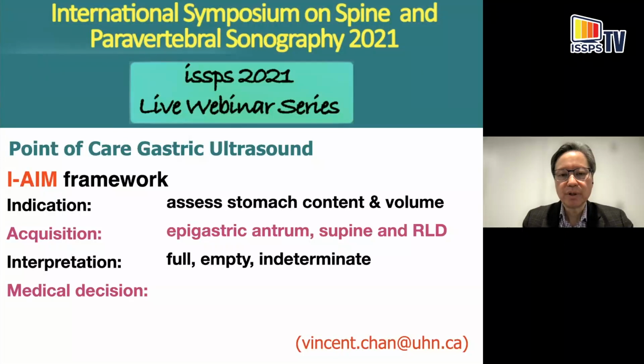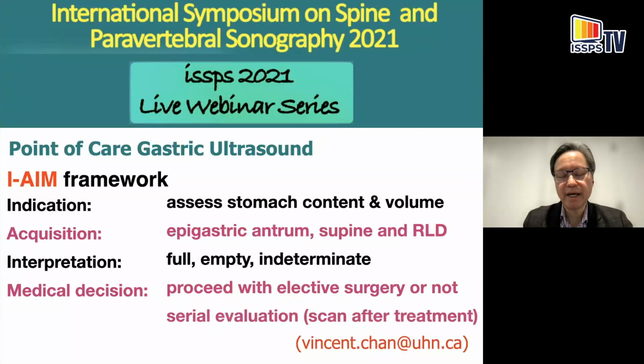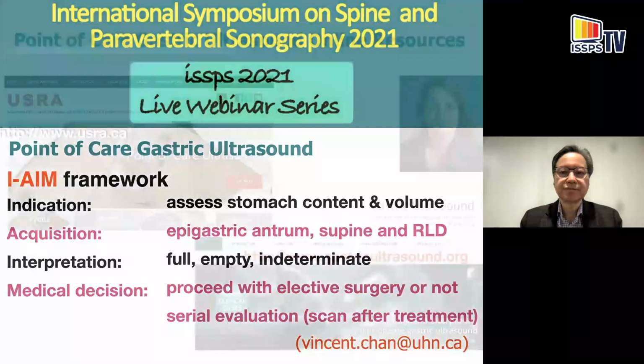You are able to tell whether it's full, empty, or in some cases inconclusive. You have to accept that. And finally, medical decision: if it's elective surgery, you may want to delay if it's a full stomach, or if it's emergency surgery, you may want to further empty the stomach before you proceed.